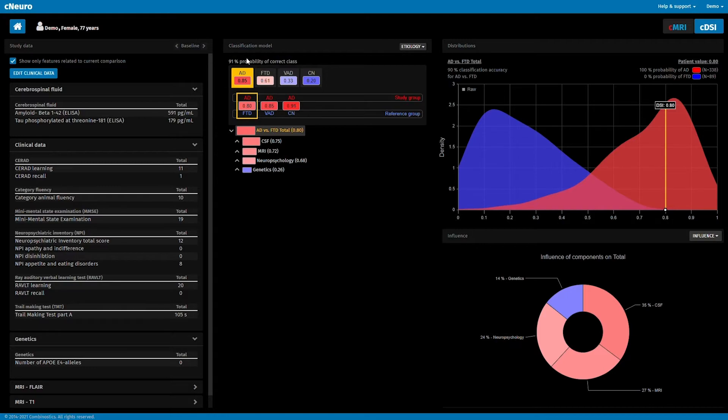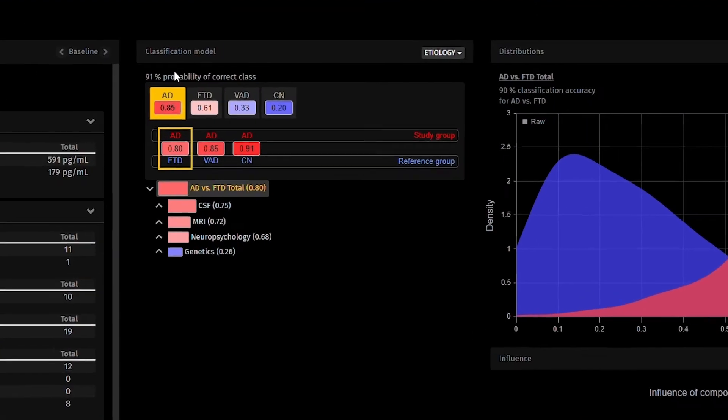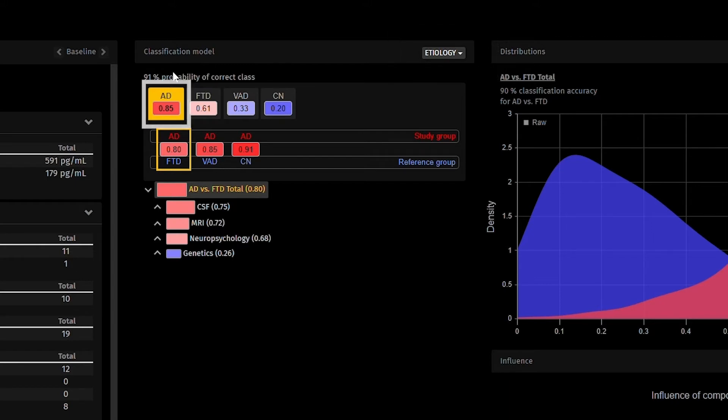First, let's review the information presented in the etiology model. For this patient, the system suggests that Alzheimer's disease is the most similar diagnosis, with frontotemporal lobe dementia being the second most likely.